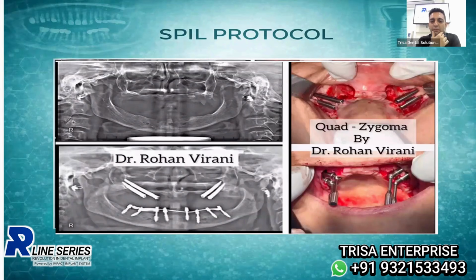And in the lower jaw, the resorbed mandible, wherein the all-on-four was not possible in the anterior mandible because it was ultra thin and fragile, managed with BCS implants and intraoral welding to give this lady an amazing smile. How many of you have seen the video of this case also, which I posted on the social media?